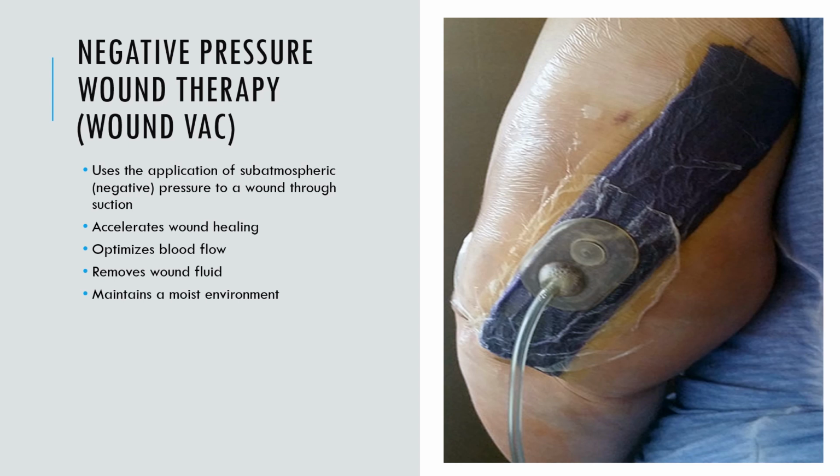Next is the negative pressure wound therapy. It is also called a wound vac. Some of you have probably encountered it in the clinical area: a black or blue looking foam with a little suction on it. This is called a vacuum assisted wound closure.